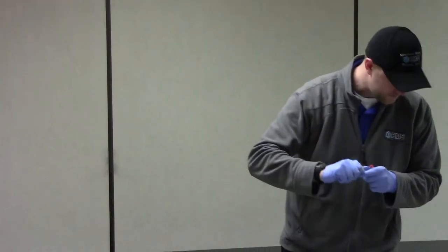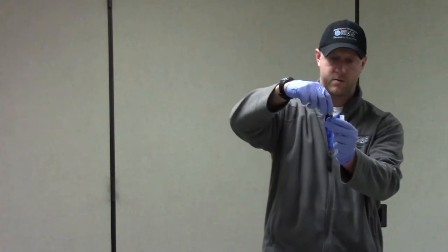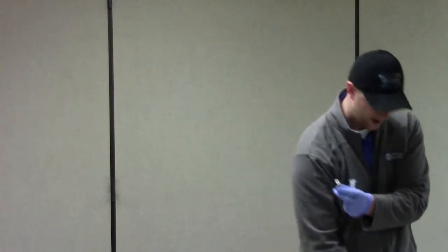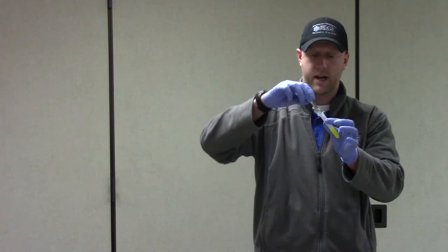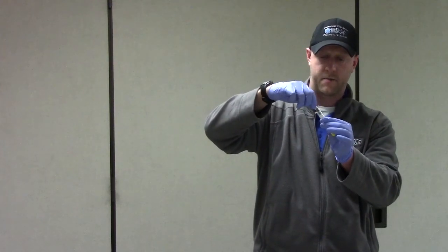the correct medication. To assemble our medication, I'm going to pull the yellow cap off the back of the syringe. The red cap will come off of the Narcan. Now, if you have a different concentration of Narcan, because it does come in 0.4 per milliliter, it'll have a purple cap. Then we slide that in place and give it a twist to seat it.